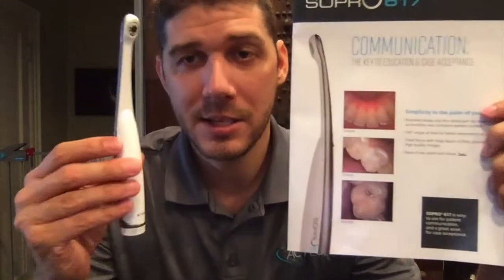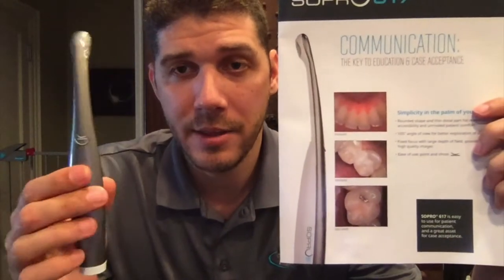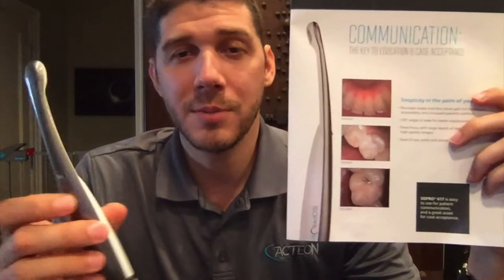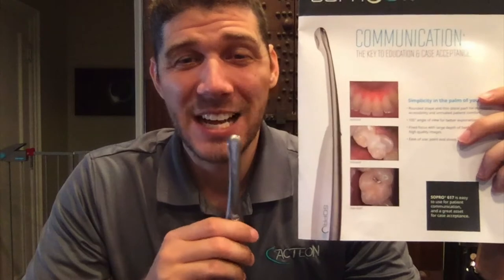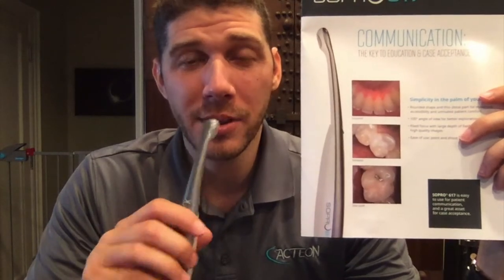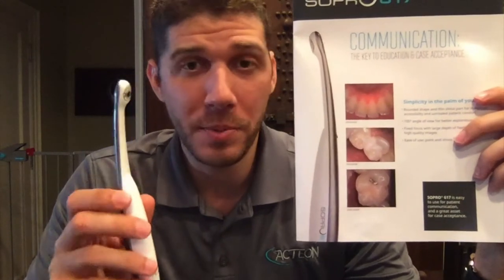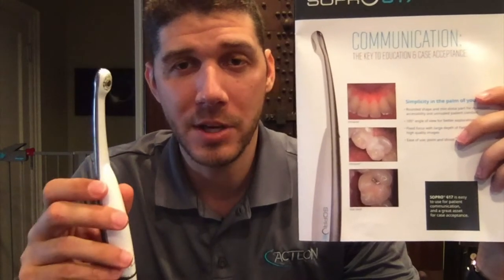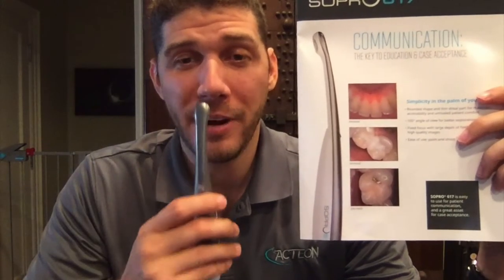The SOPRO 617 is this camera here. This is a fixed focus length camera, meaning you're going to be able to do a smile, an arch, a single tooth — all within the focus range. So you're going to get a beautifully crisp image of those different areas.